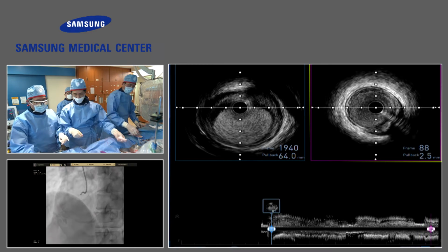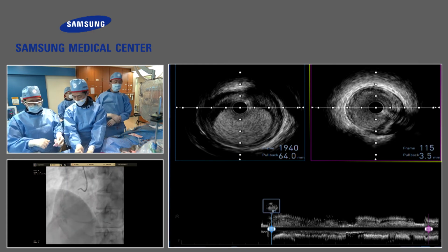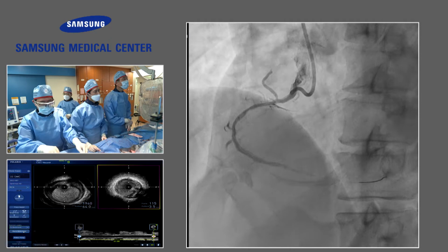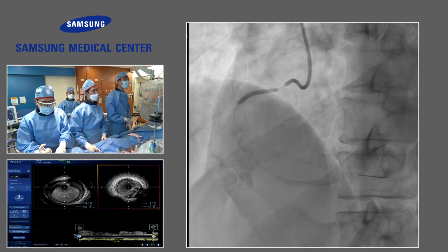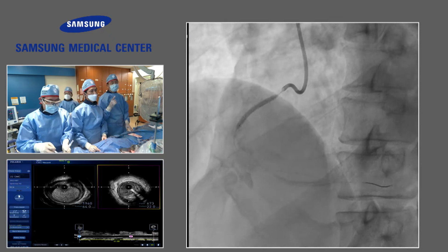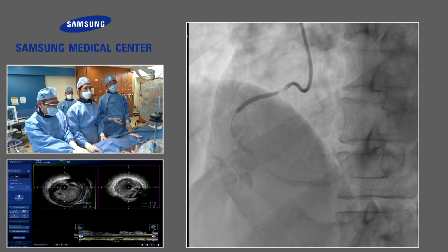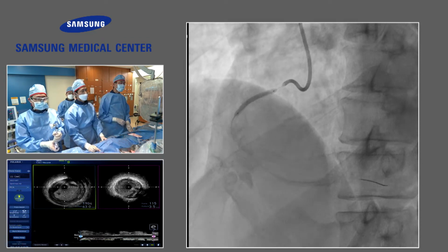Anyway, for the first selection of a stent, maybe 3.5, okay? 3.5, 48 is okay? Please show the previous angio. The previous balloon was 2.5. Yes, 4.0 is too large. The vessel size is actually 4.0 to 4.5, possibly remodeled. At the distal end the vessel size is actually 4.0, but the lumen is 3.0. Starting with 3.0 is better.